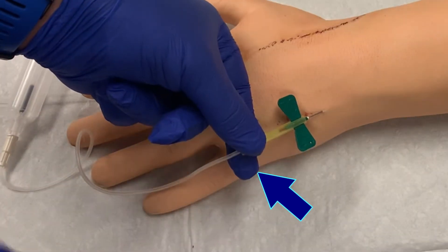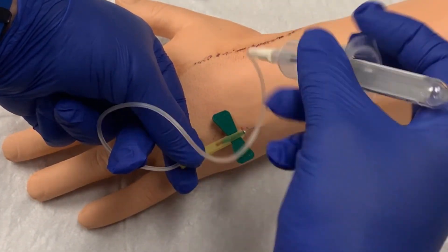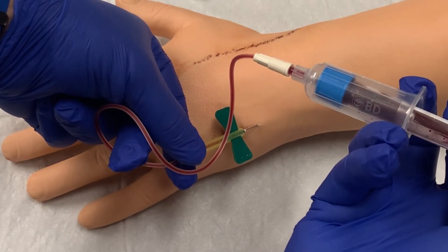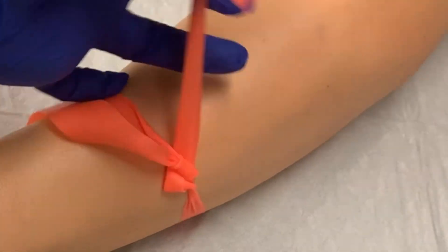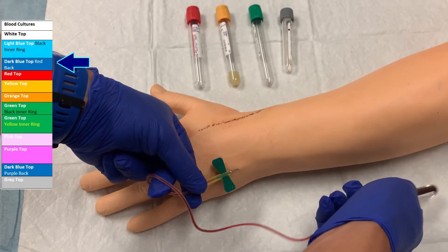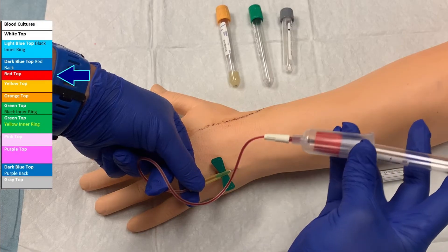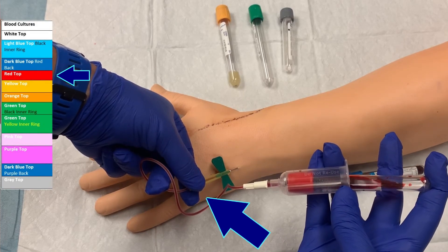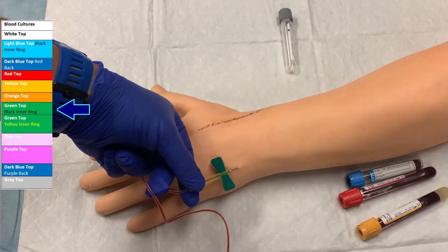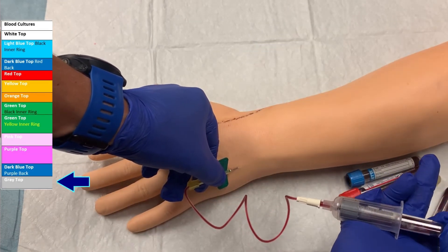Once in place, use one hand to secure the position of the butterfly needle in the patient. With your other hand, insert the first tube into the vacutainer adapter and push it down onto the needle. If the butterfly is still in the vein, blood will immediately begin to fill the tube. Release the tourniquet from the patient's arm at this time. Allow the tube to fill completely — they are pressurized to pull the appropriate amount of blood, and when they are full, they will stop filling. When the tube is finished filling, remove it and insert the next tube, but continue to stabilize the butterfly with your other hand. If you let go of the butterfly to use your other hand, the needle may become dislodged and you will need to poke the patient again.